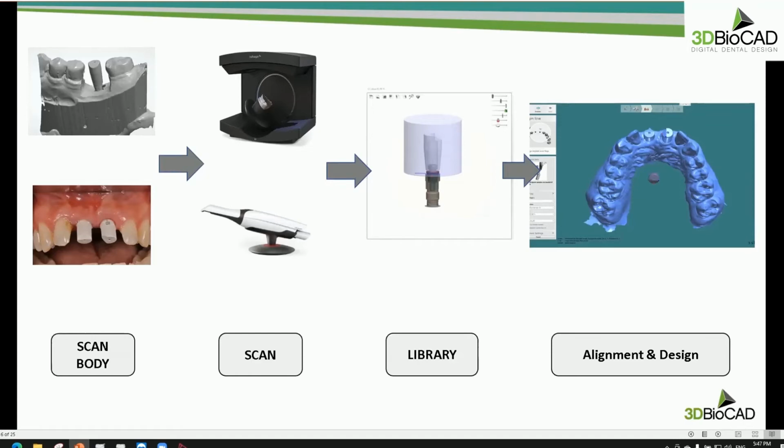Okay, so clinical side for doctors wise actually doesn't really need to understand what is a CAD library is, but it will be very good to know because if you see like small map on here, we can see multiple elements are there because when the implant company making some part scan bodies, titanium bases, some implant analogs, they make like a CAD map, which is they all combine on the same position as like this view.